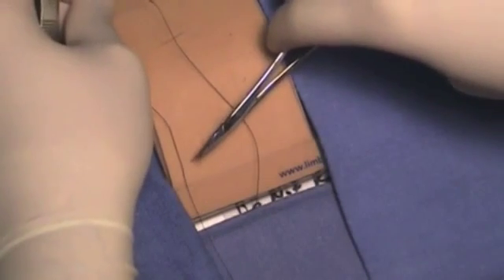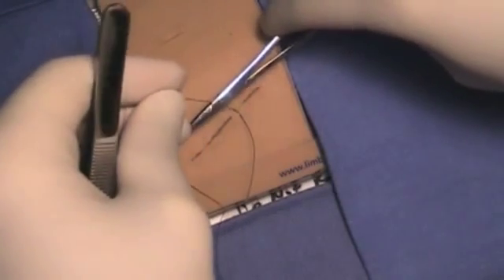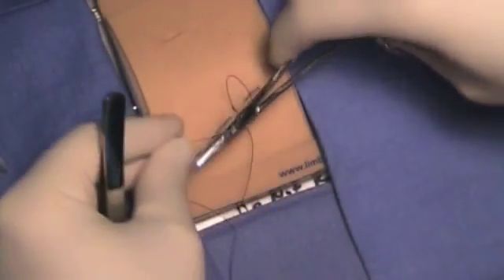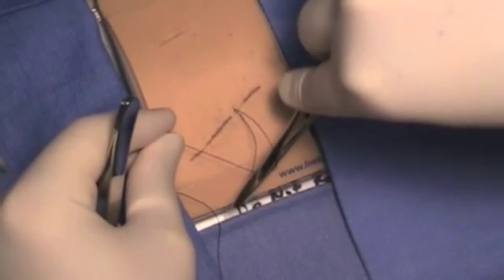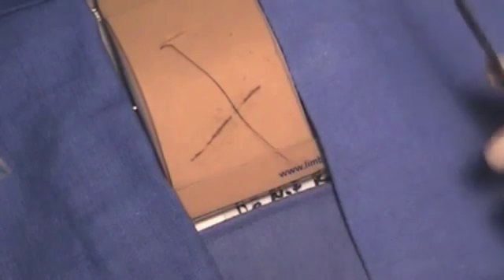For the second throw, again put the needle driver above the wound on the inside of the suture material — this is the inside versus the outside. Wrap once on the inside of the suture material. Grab again one centimeter away from the tip of the short end and pull away from you. That completes one square knot.